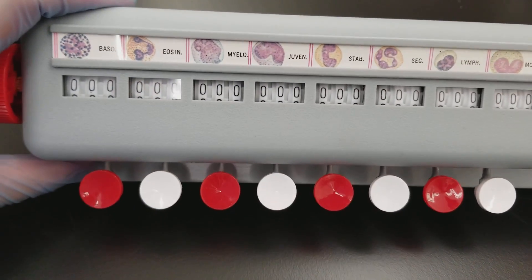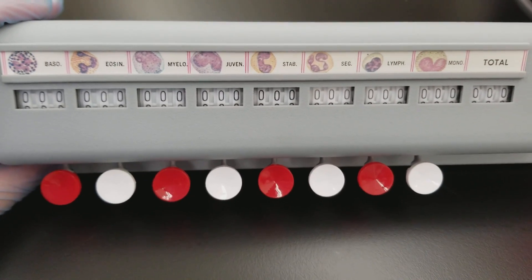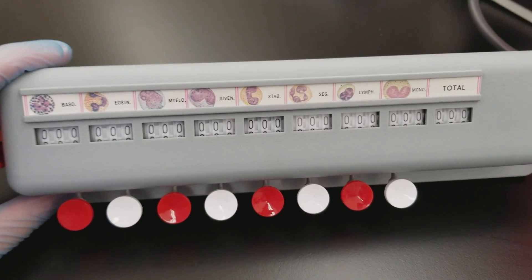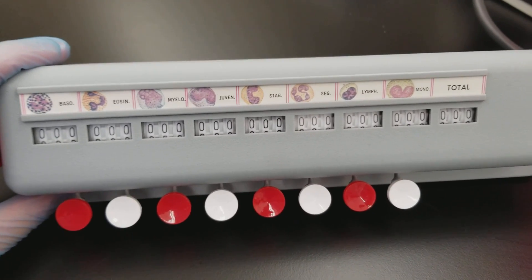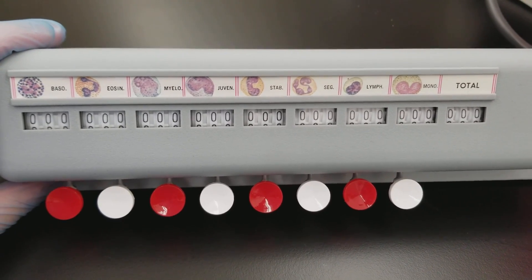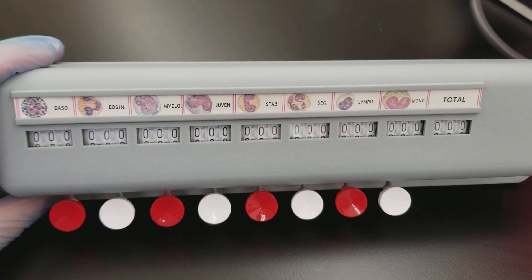But you may see the immature white blood cells only in the thick area. So make sure that you scan the entire smear before you start your count in an area where red cells are spaced out nicely.